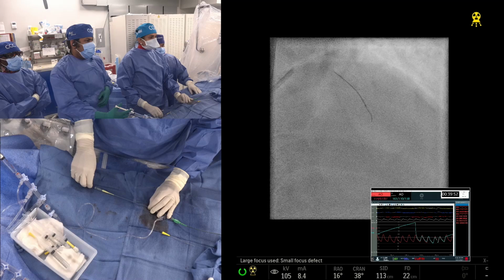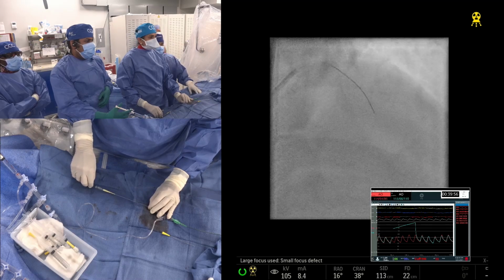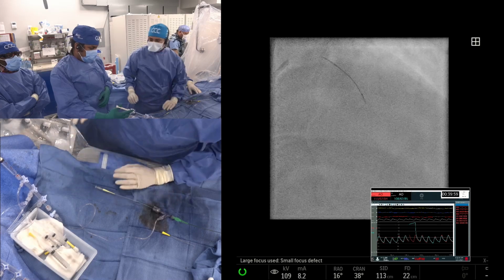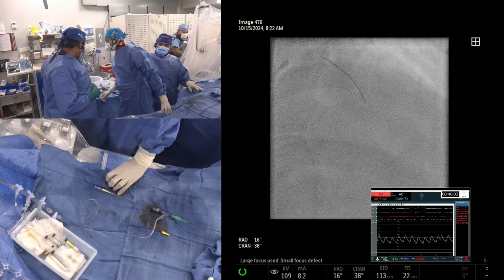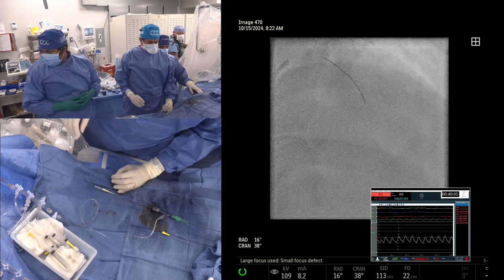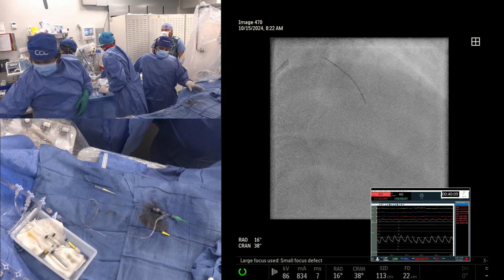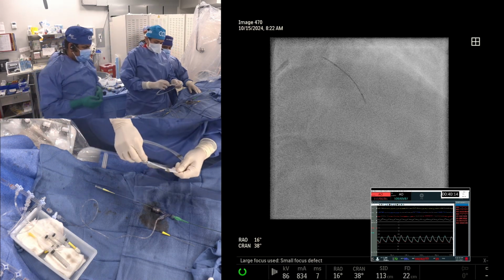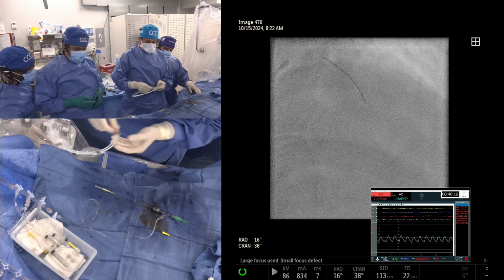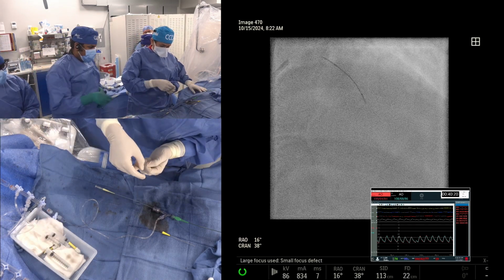But the rest of them, the key is that they are referral cases. I actually have the designated 10 interventions. 7 are referred from outside, and two of them have failed Miracle outside. So you know those cases are very challenging and will take a lot of time. A failed attempt is included in the complexity and the classification. Yeah, that's right, absolutely. A failed attempt is one of the important factors in the J-CTO score.